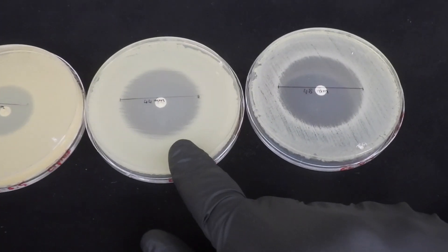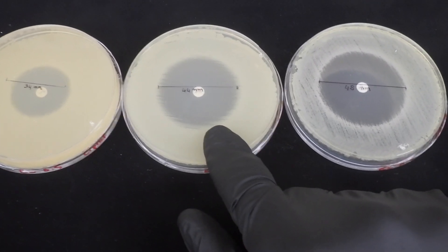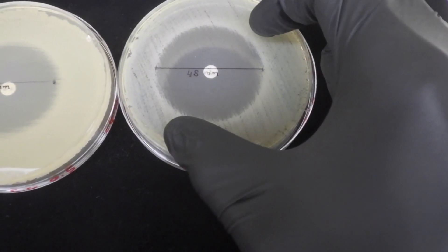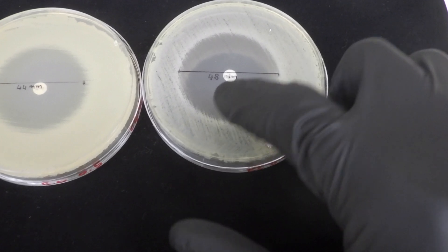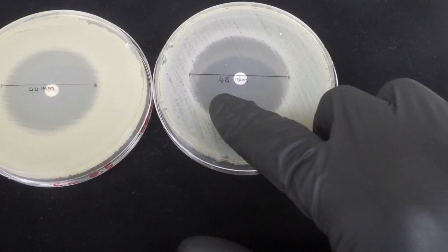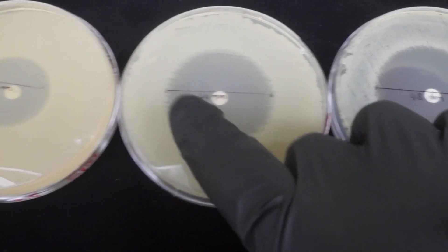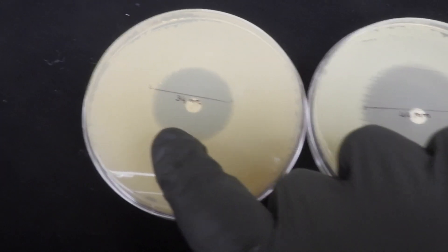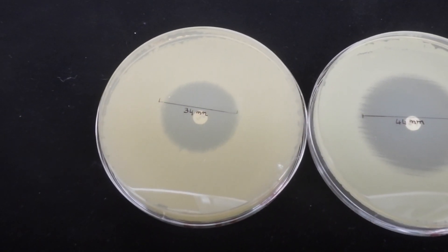In the center we have our reference conditions where the Mueller-Hinton agar is four millimeters thick. And then on the right we have thin agar where the ciprofloxacin can diffuse out further. You can appreciate that from our thin agar where we have a zone diameter of 48 millimeters to 44 with our reference condition, all the way down to 34 with our thick agar, the thickness of the product does have a true impact on the result.